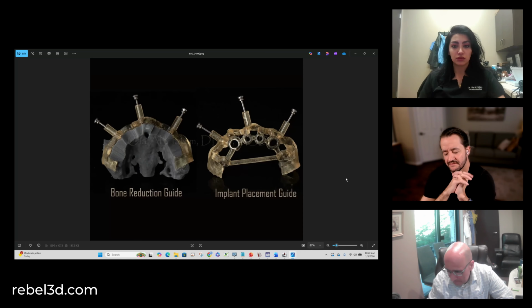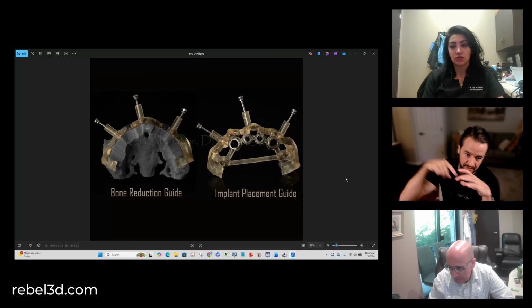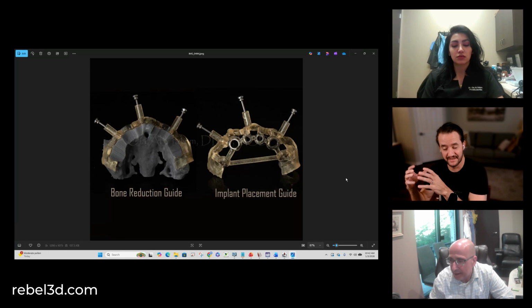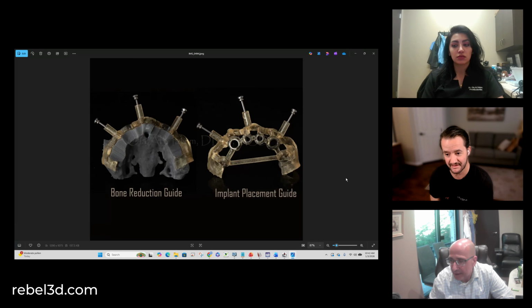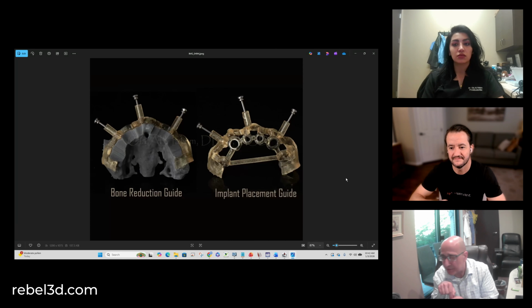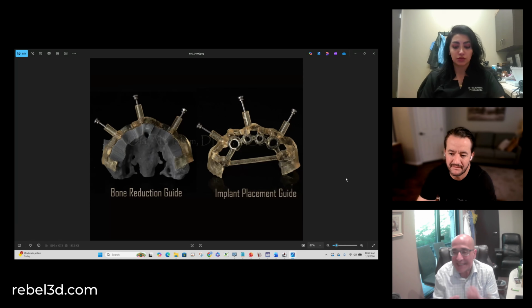Yeah, so with a static guide you can only go in one angle, you might not get the implant stability that the plan is giving you, and you have no ability at that point to try a different method. Exactly. Try to go a little bit angled right or left, something that you can see on the spot. No, you have no choice. Whatever plan is planned.